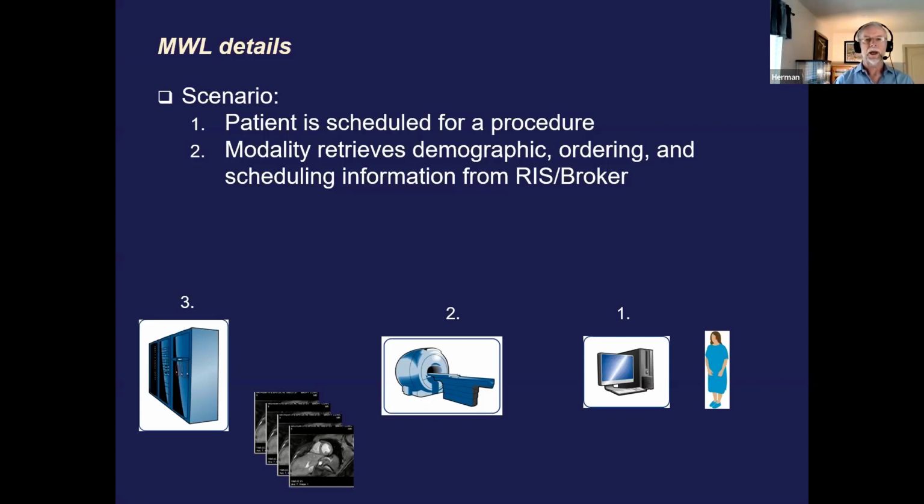So that's demographic information. And it's actually a little bit trickier to make sure that all of the information that you typically want is part of the worklist, right? Sometimes I get hospitals that say, well, what about, and I came across, the last menstrual date. Oh, is that in there? Oh, so we might have to do some mapping. So patient demographics, and then ordering information, of course, very important.